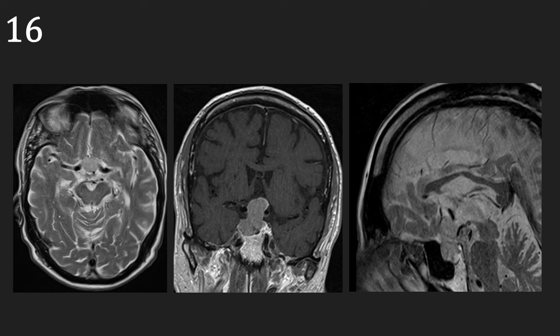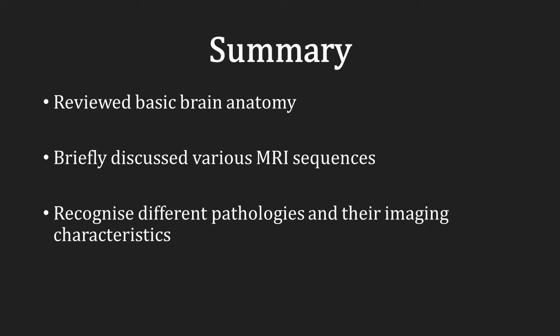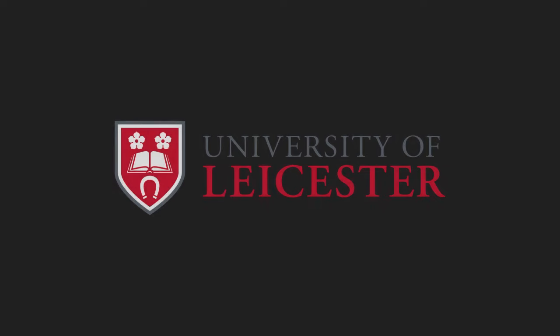Our final case is of an 84-year-old female patient who presented with bitemporal hemianopia, confirmed on clinical examination. Here, we can appreciate a large mass lesion in the pituitary fossa, extending upwards to compress the optic chiasm. This leads us to the diagnosis of a pituitary macroadenoma. In summary, we have reviewed basic brain anatomy, briefly discussed the various MRI sequences used to examine the brain, and applied this knowledge to recognise different pathologies and their imaging characteristics. Thank you.